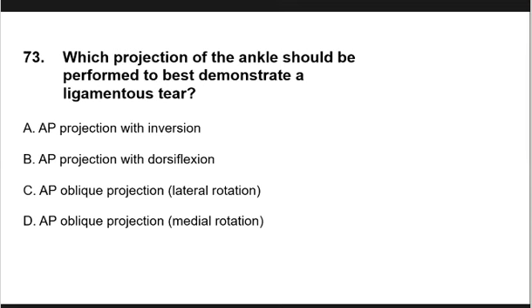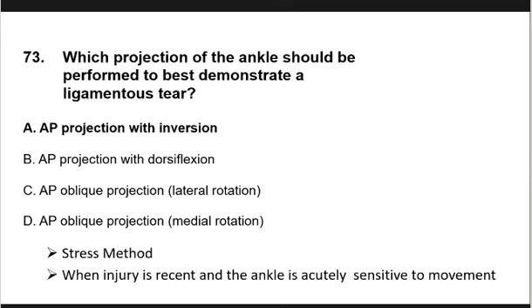Yan. So dito sa projection, which is used to demonstrate the ligamentous tear, our answer here is AP projection with inversion. Ito yung tinatawag natin na stress method. Stress method that is used to demonstrate the ligament tear or rupture.